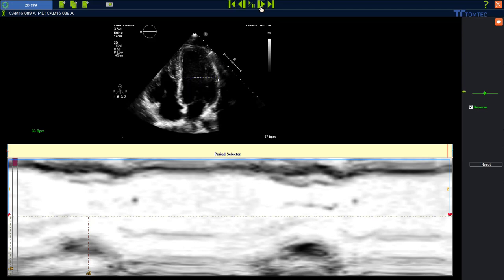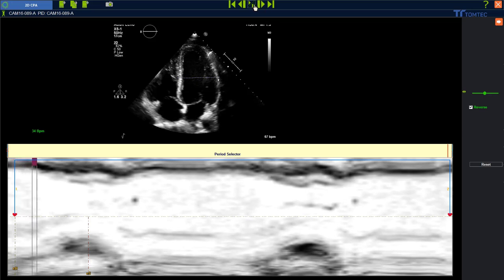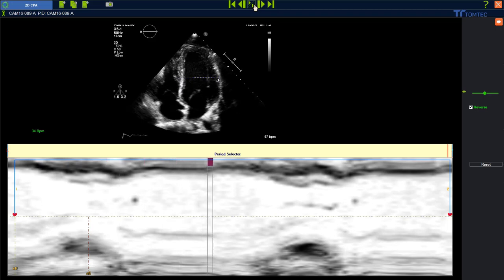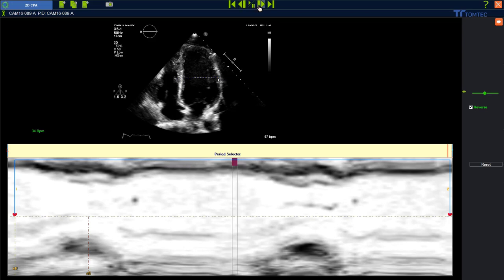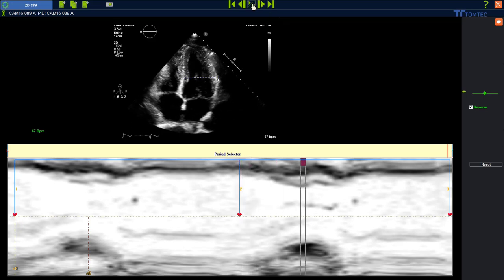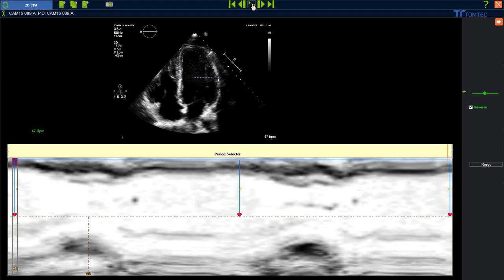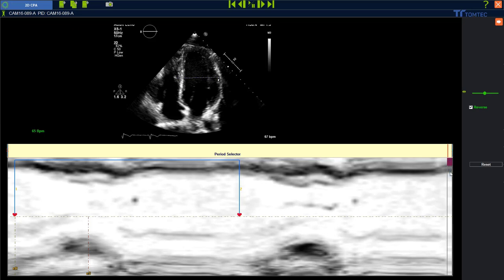Stop again and then go frame by frame to see if we really have two beats. In this case it seems to be two heart cycles. The first thing to do is set the first R wave — the end diastolic phase information. Play the loop, look for the second R wave, then click once with the left mouse and double check the last R wave. In this case we can see the third R wave is cut off again.